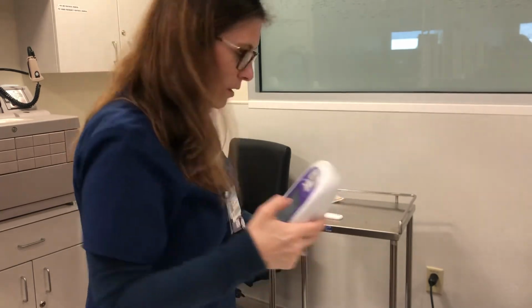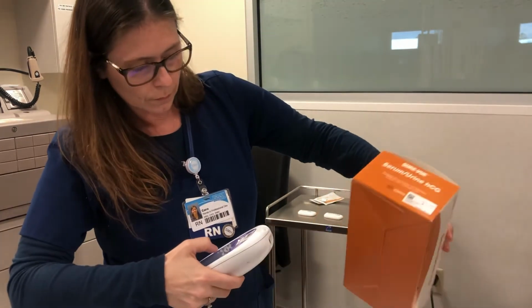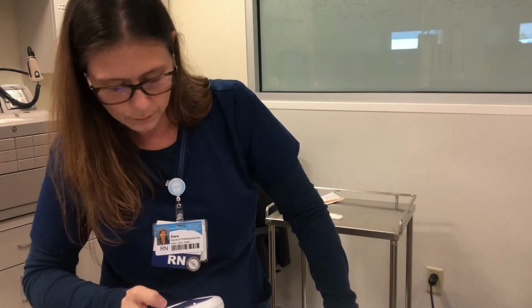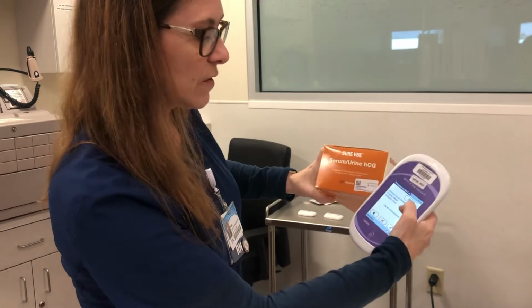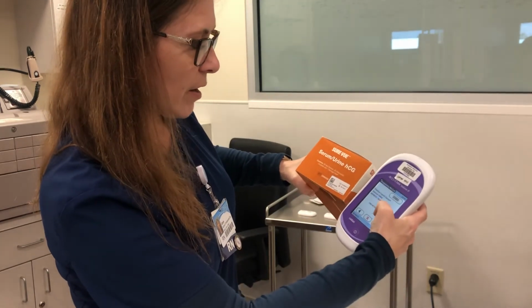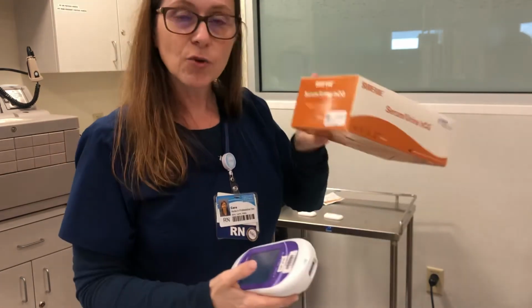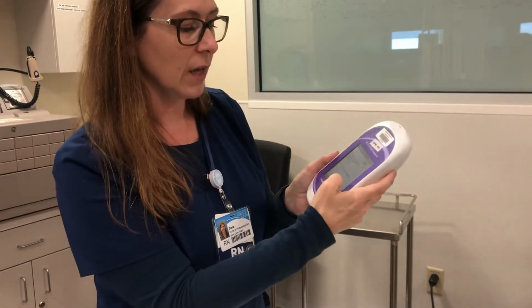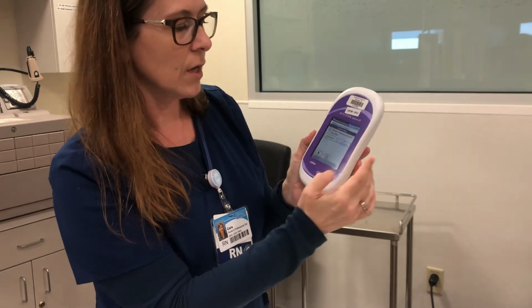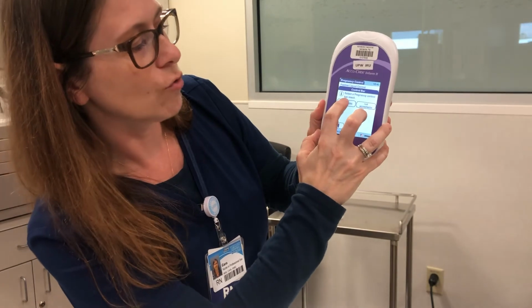And our pregnancy kit. And it's actually in here, so you could scan it, but I'm just going to compare. It ends with 32121, and that is correct. If you have a new kit, you need to manually enter that in here. You can scan it, or you can manually enter. So that is us, and it says, do you have a control line?